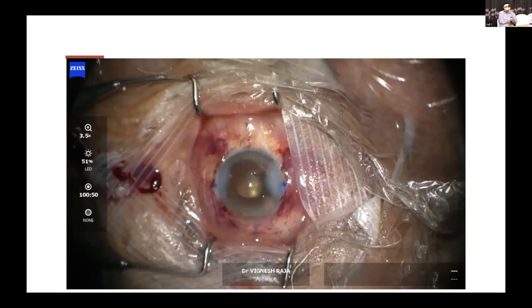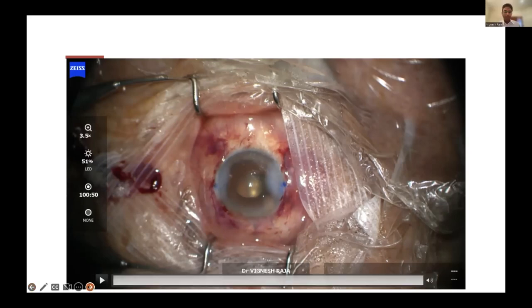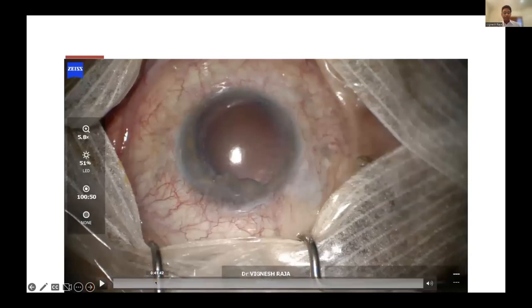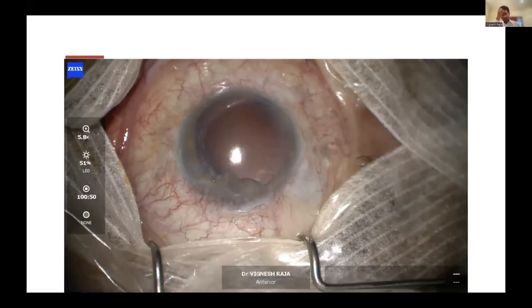Yeah. Correct. So then the next case was my fourth case. This time I watched Ike Ahmed's video where he did a case of fixating the Zeiss CT Lucia on the Yamane technique to the iris.